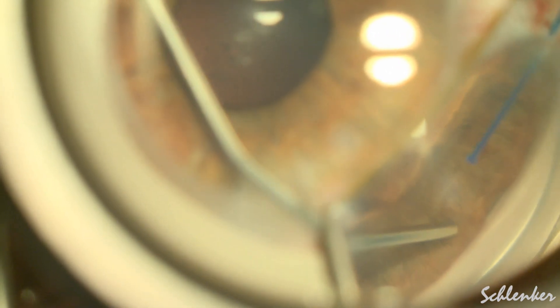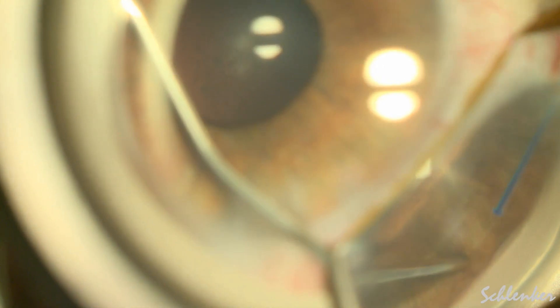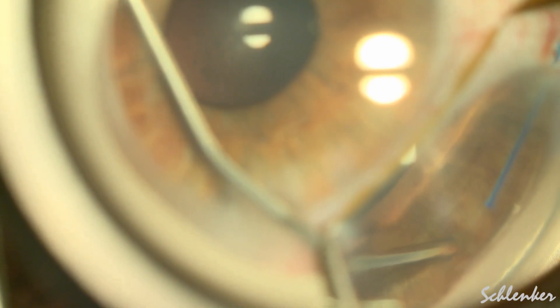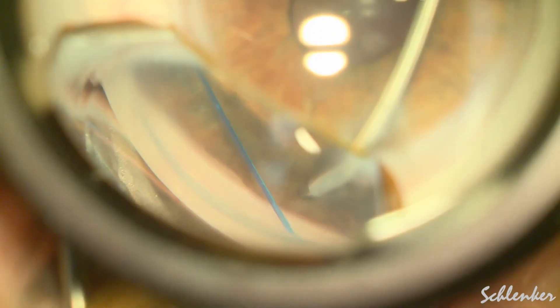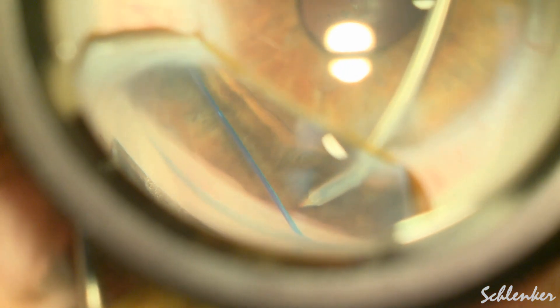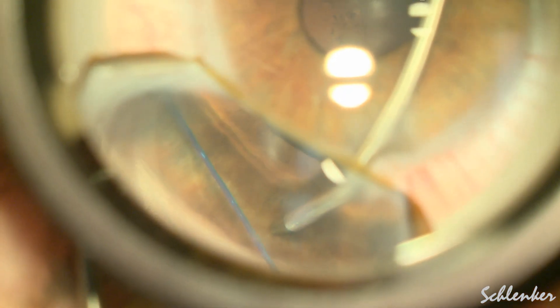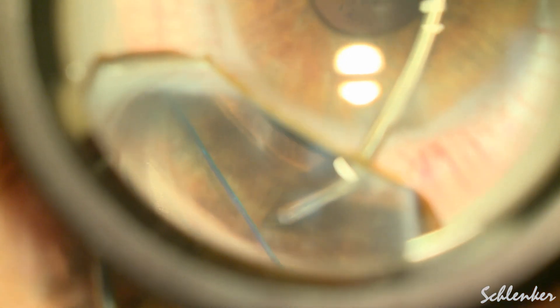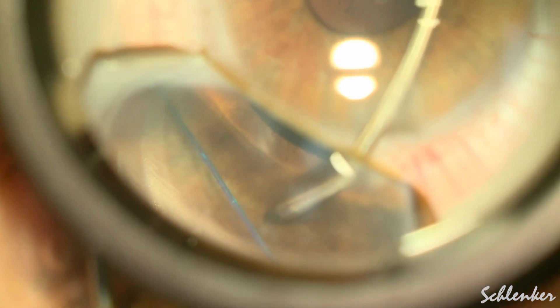I do have some situations where I've ended up ripping through the peripheral anterior synechiae, though given how easily these areas came down, I thought it was prudent to go around 360 degrees and bring these synechiae down before performing the GATT. And in this situation, because I'm not sure what's going to happen with these PAS going forward, I thought it also wise to just do 180 degrees, which is really my preferred approach for GATT.